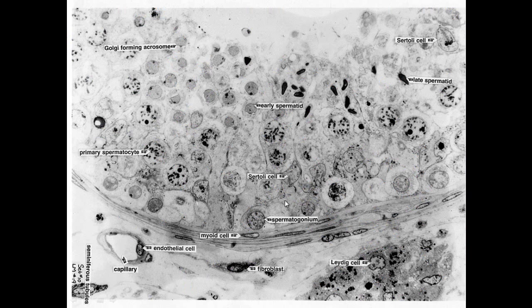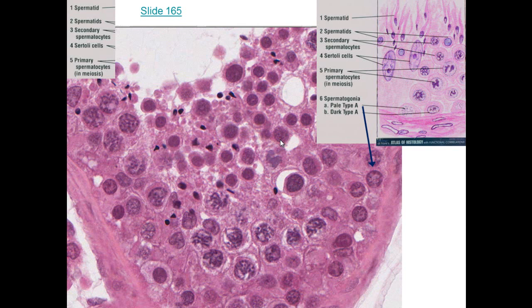Here we have spermatogonium. There's a Sertoli cell nucleus there, and there's one here, a nice pear-shaped Sertoli cell nucleus. And then we see the spermatids. So these are nuclei of spermatids, and we see a little cap, the acrosomal vesicle, in cap phase spermatids. And these are the ones that look like bullets. These are the ones that mature. So you've got spermatogonia, spermatocytes, and spermatids. And we can see those in a drawing and in the real tissue.